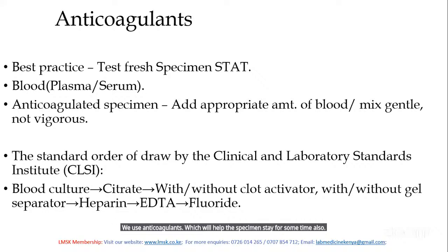So when you add anticoagulant into your specimen in the tube, make sure you use an appropriate proportion of anticoagulant with the blood. You mix gently, avoid vigorous mixing.